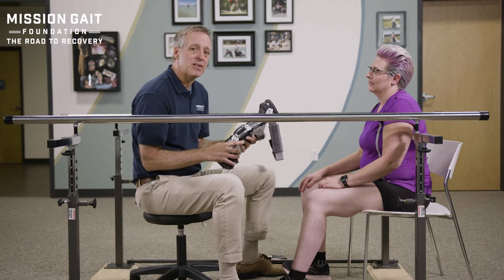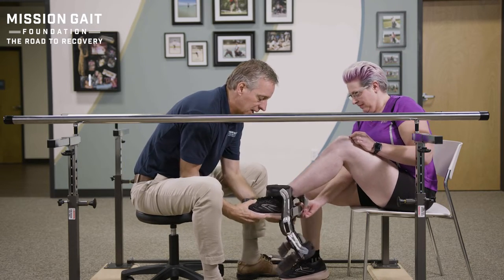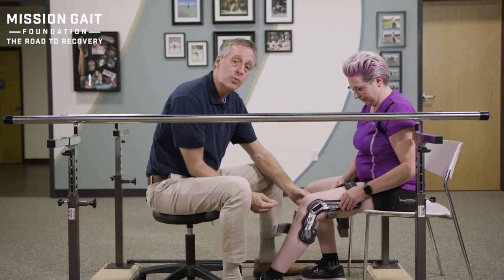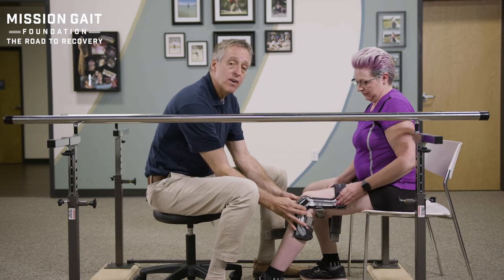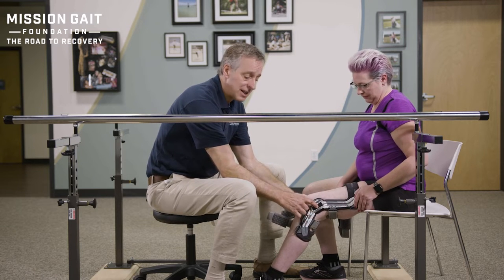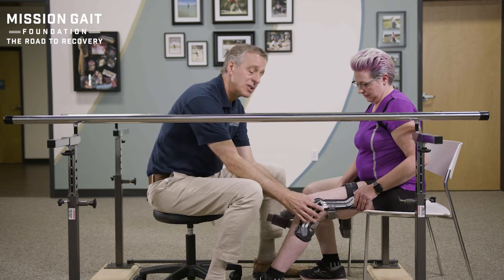So we want to start with the donning process. You're going to have the person step through the brace — in this case, have Sarah pick up her foot, step through, clear the back strap, and come all the way into position. Most people would think the knee brace fits right over the center of the knee, but the biggest mistake is patients put them on too low, too far back, or too far forward. You always want to slide the brace up until the brace joint aligns with the top of the kneecap — not the middle, the top — much higher than you would think.